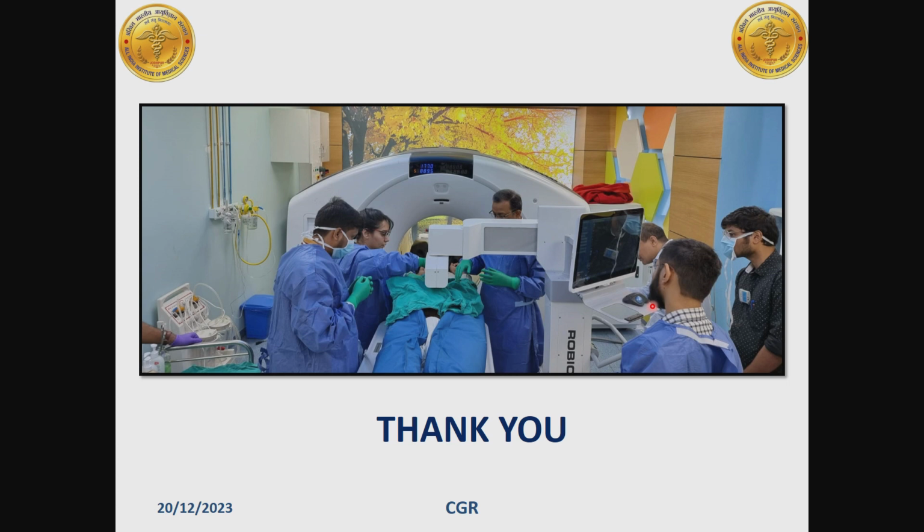Okay, and we have other applications in cardiology like MUGA, ejection fraction estimation, left ventricular function. They do 2D echo, but on 2D echo you won't be able to get that myocardial function, so that is what they ask from us. They can get the movements only, but how much is the differential movement, or which part is how much affected, that we can give from here. That is the difference.